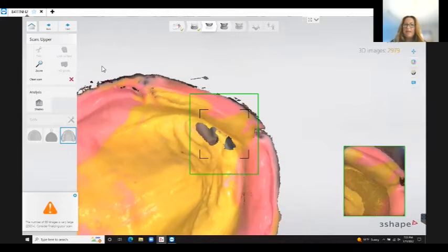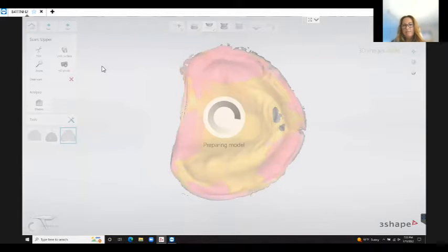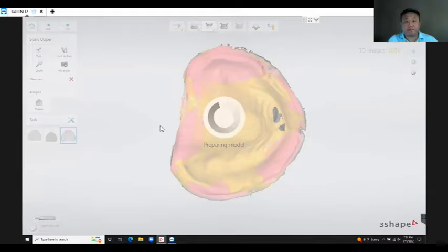Also, I'm going to add in here too, while Bannister's scanning, don't worry so much about the count. I know that for crown and bridge, for restorative, you kind of keep an eye on that because you want a lower number. And this, it's not going to stop on you. So it just takes longer to process. A lot of times this will spin around for a while. Isn't that correct, Benister? Yes. And he'll go over that. Thank you.